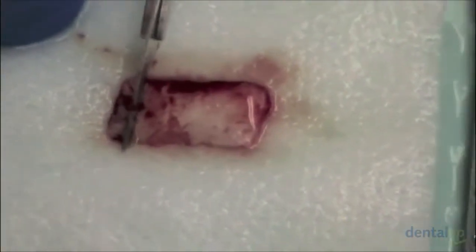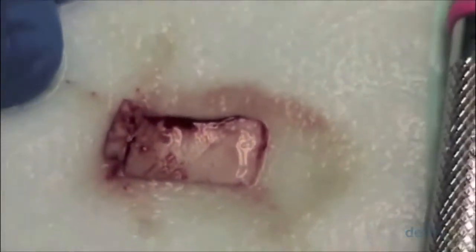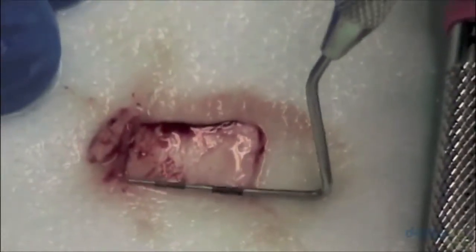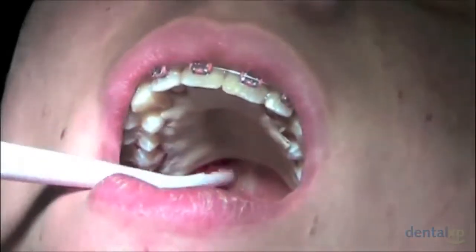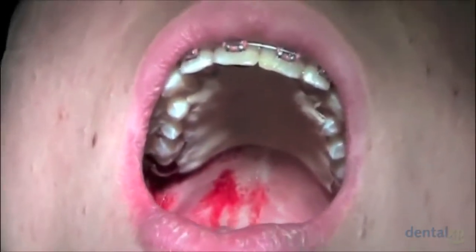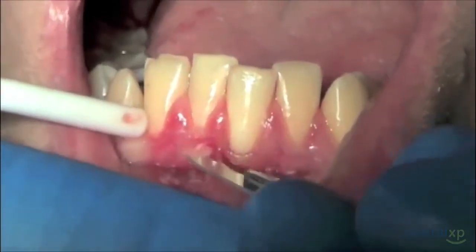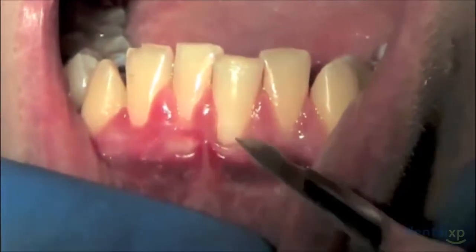At this point, what we're doing here is placing the free gingival graft on a moist gauze and simply trimming the graft to fit properly into the recipient bed. Once again, a 12 millimeter graft is pretty typical for the recipient bed from number 24 to 25. And here you can see the acrylic stent in place for the maxilla. This will help in achieving hemostasis once the patient gets home.